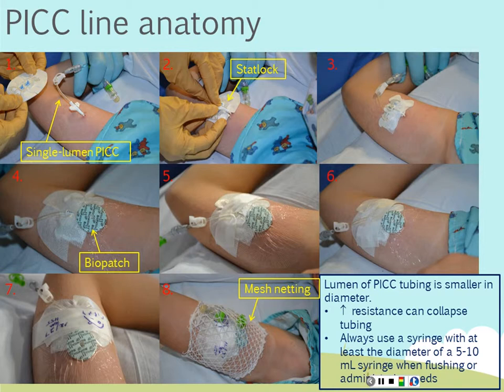Depending on the facility you're at, the nurses may change central line dressings at the bedside, or they may have an IV team that does that. So that's included, with the date and time when the dressing was changed. And because of the tubing and anything else, we definitely don't want to pull out any IV, but definitely not a central line. So you see there's just that cotton mesh stockinette netting that can be pulled over their arm, that can be moved to assess the site as needed.